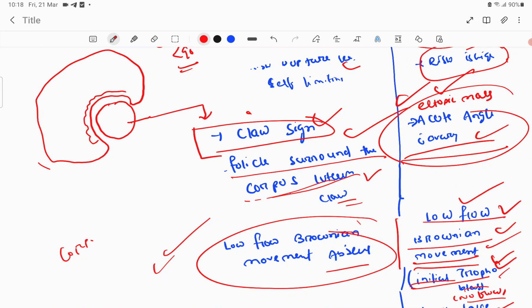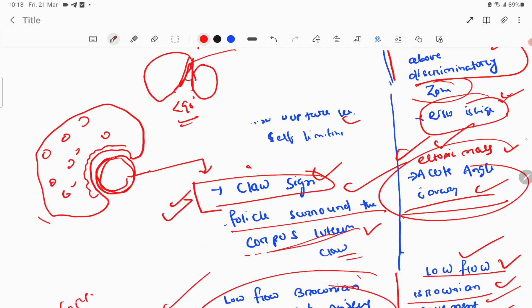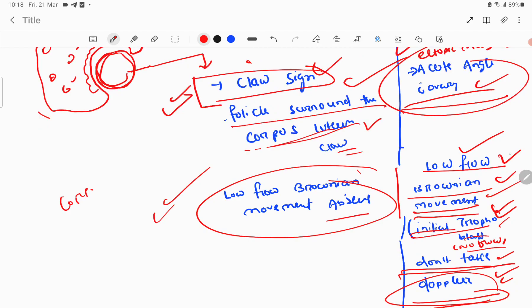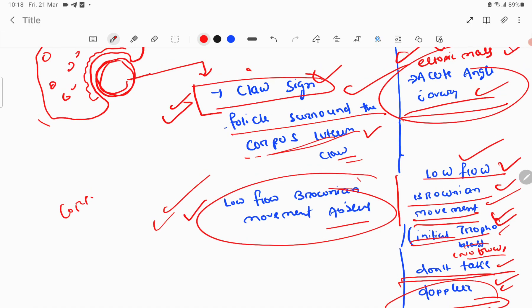The claw sign differentiates the two: in corpus luteum, the lesion is covered like a claw by follicles and ovarian stroma. In ectopic mass, there is an acute angle with the ovary. Low flow Brownian movement is present in initial trophoblastic flow of ectopic pregnancy — do not use Doppler in early ectopic. This movement is absent in corpus luteum.